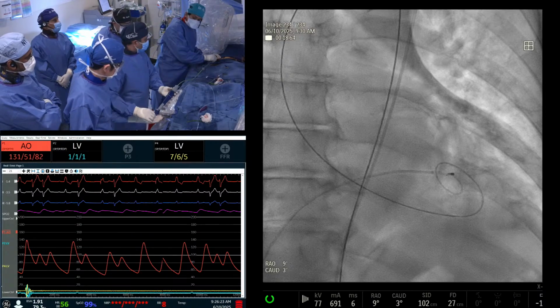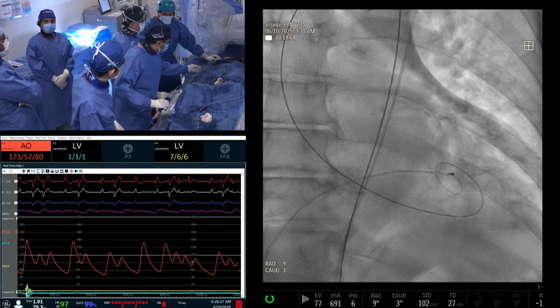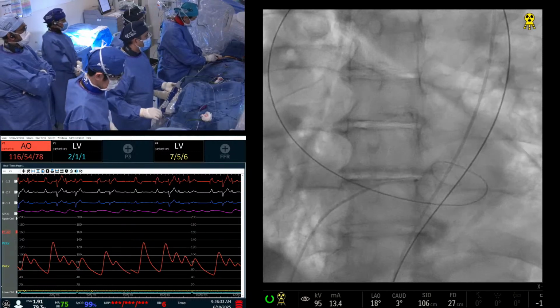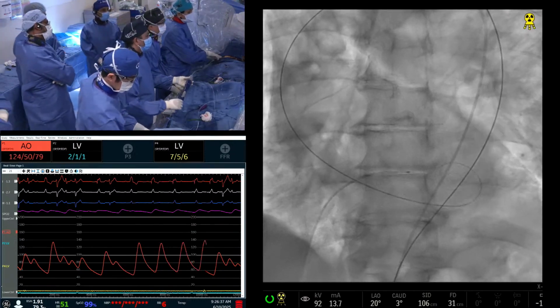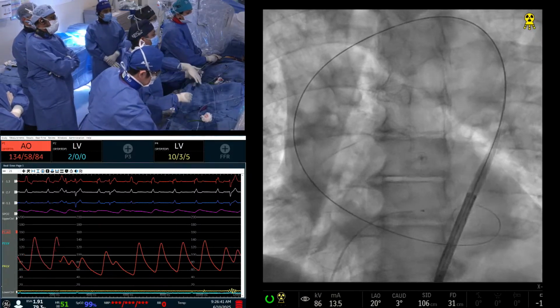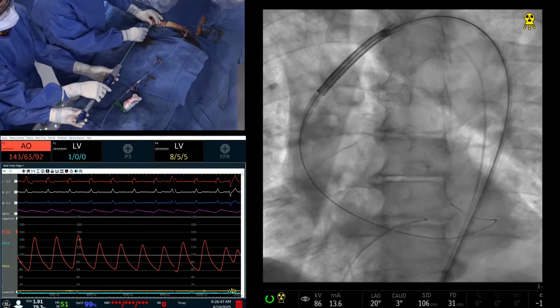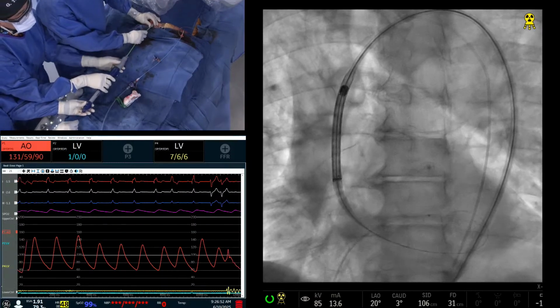Yeah. Because with a surgical valve nobody will touch it. Remember how they do it, right? They remove it, they place it, and the valve is opening. There's no post-dilatation. Correct. Here, we often post-dilate. But remember, so far, compared to surgery in those randomized trials, our valve has performed better than the surgical valve in terms of valve degeneration, residual gradient, and the follow-up effective aortic orifice.